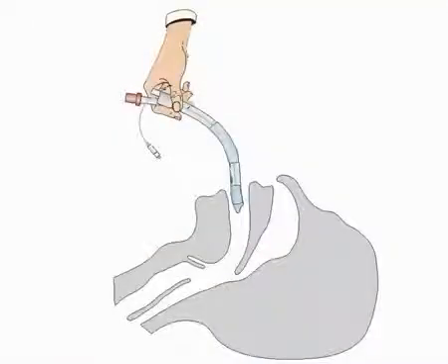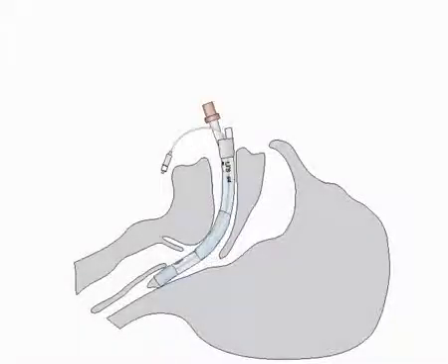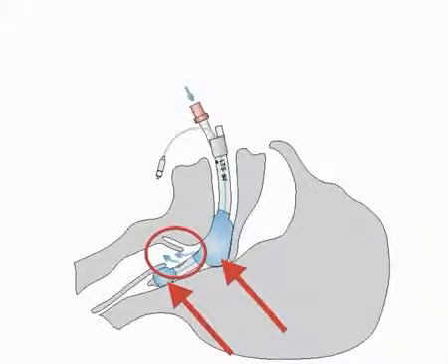Due to the shape and design of the tube, a blind insertion without laryngoscope is possible. The proximal cuff seals the oro and nasopharynx, the distal cuff seals the esophagus and reduces the risk of gastric insufflation. Between the two cuffs are the ventilation holes, which lie in front of the larynx.